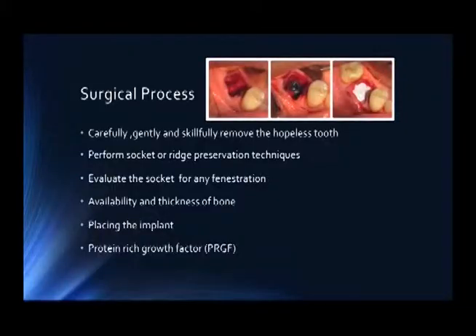So just to then press on, we've got our surgical process beginning by the surgical doctor very carefully, gently, and skillfully removing any hopeless teeth, and then evaluating the socket and making sure there's enough material present, or augmenting the material that's needed to be present, checking the availability and quality of the bone where the implant is going to be placed, and then placing the implant.